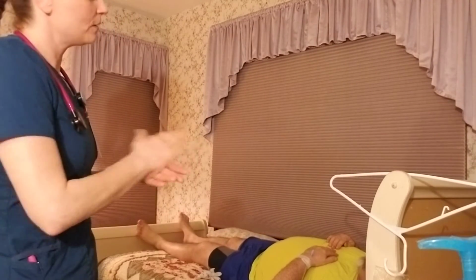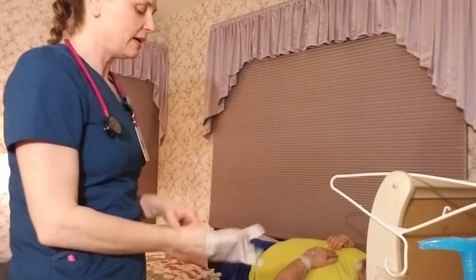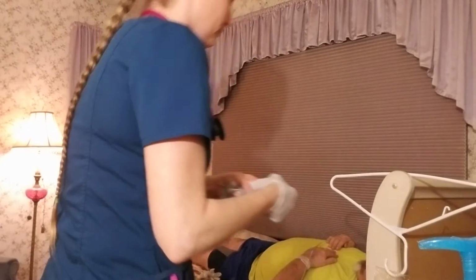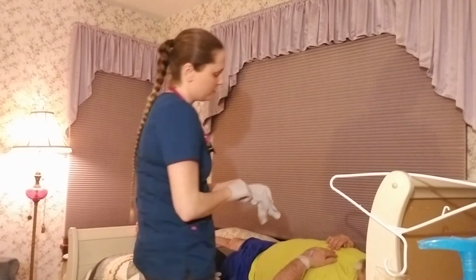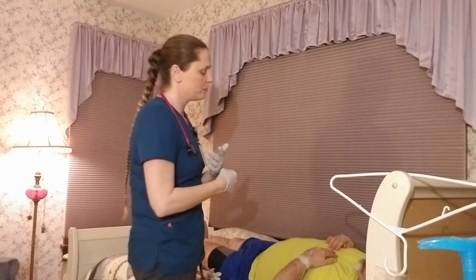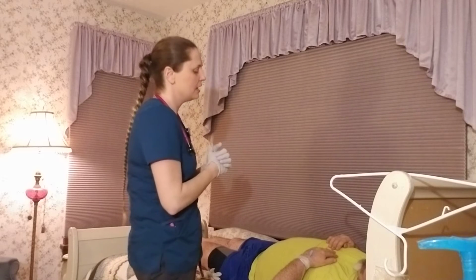Hi, my name's Cheryl. I'm going to be a student nurse helping take care of you today. I just need to do a quick head-to-toe assessment on you. Can you please verify your name and date of birth? Ryan Vansquist, June 6, 1973. Perfect. Do you have any allergies? No. I'll assess the patient's vitals, checking the blood pressure, temperature, pulse, respirations, and O2 sats, and document that.